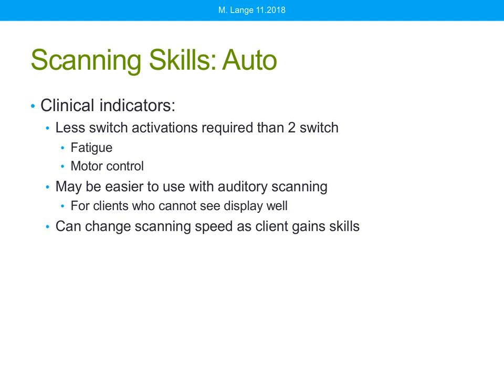For clients who use auditory scanning, I'm listening to my choices. Perhaps I can't see the display very well, or I need a cognitive aid. As I'm listening to those choices, sometimes I have found in my experience that automatic scanning works easier with auditory scanning as opposed to two-switch. With two-switch, every time I move through my selections, it can play an auditory cue. It can be a little less intuitive for my clients.